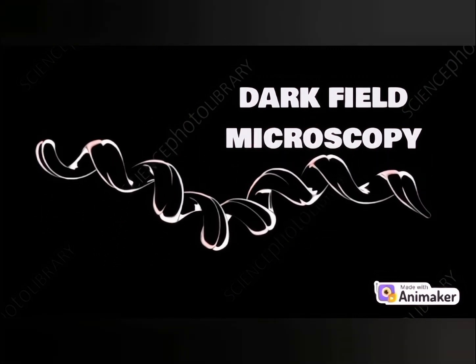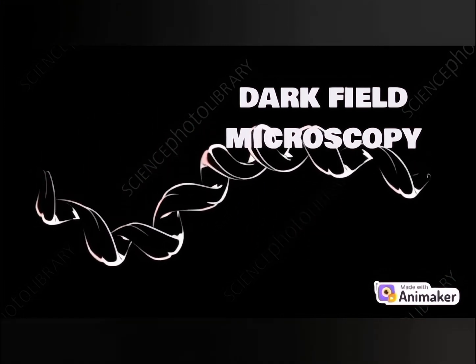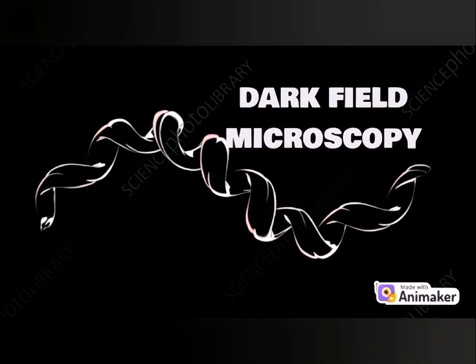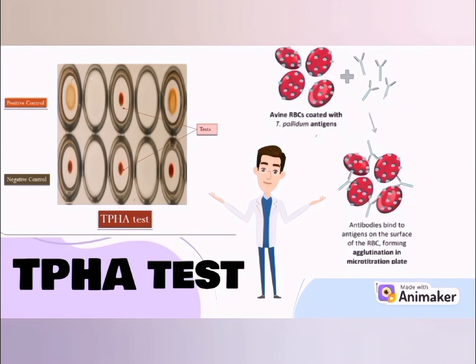This is the oldest and simplest but very reliable method. In this method, the specimen is collected from lesions and visualized directly under the microscope. No direct light passes onto the slide. Instead, diffracted light shows a bright image. The TPHA test, the Treponema pallidum hemagglutination test, is a blood test that detects syphilis by looking for antibodies against the bacteria that cause the disease.